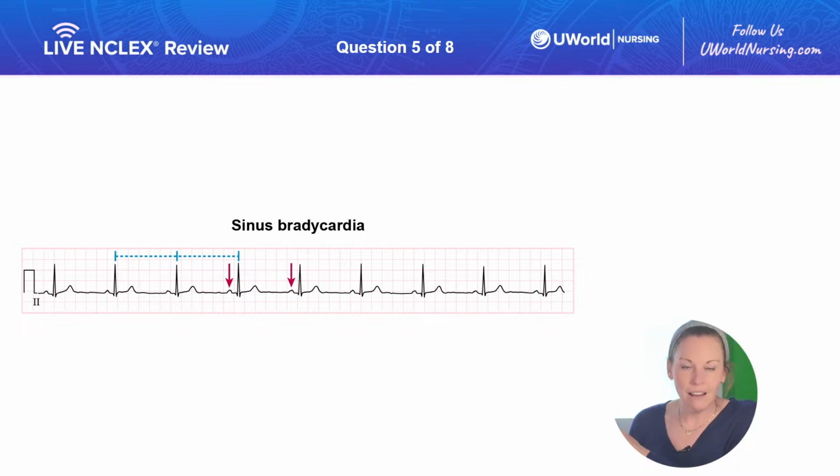But you guys did great on that one. Again, this was sinus bradycardia. Well done, you guys.